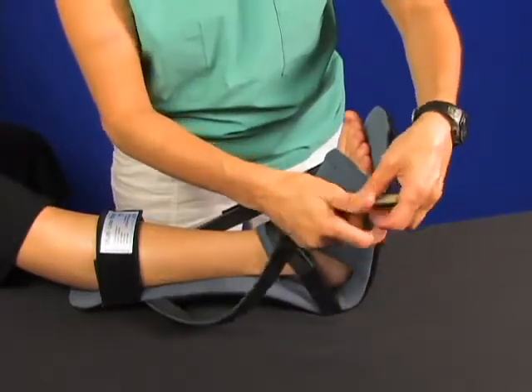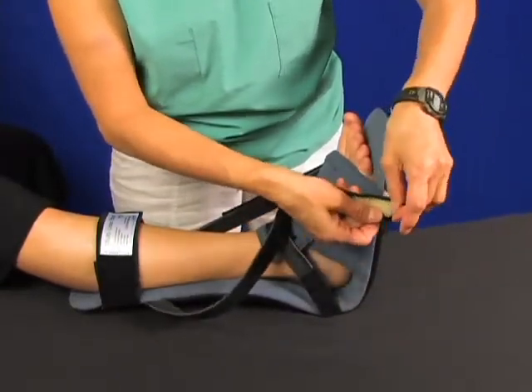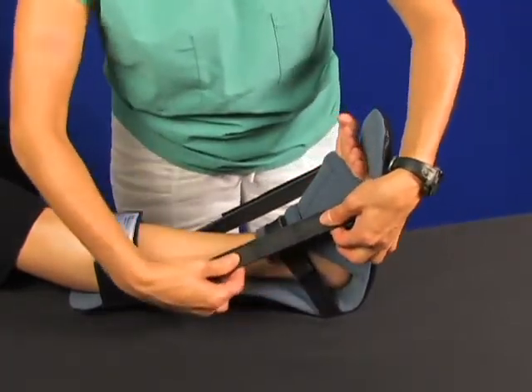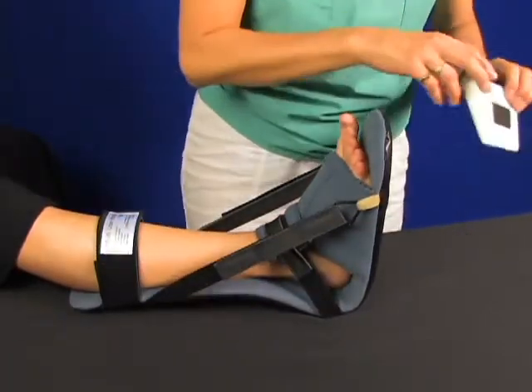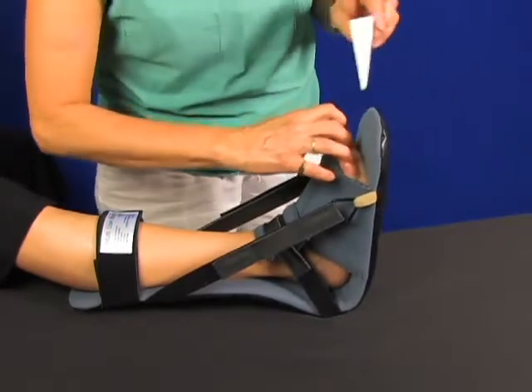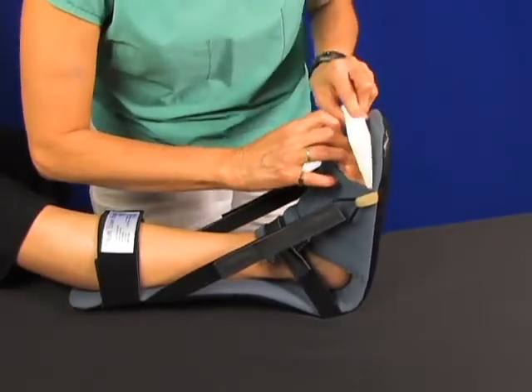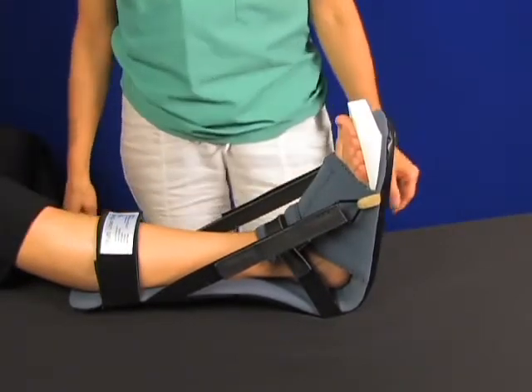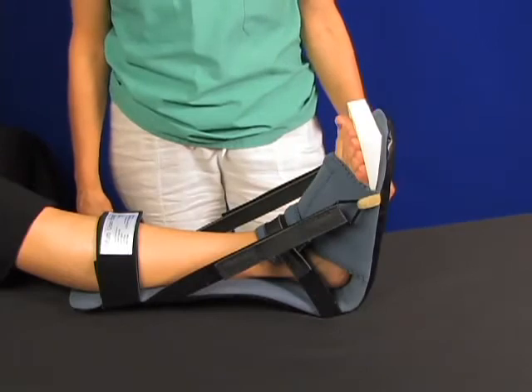Now reapply the side strap by threading it through the slot on the foot and hooking it back on itself. Finally, if the use of the toe wedge is desired, lift up the toes and slide the white foam wedge under the toes. This provides one last additional stretch to the plantar fascia.